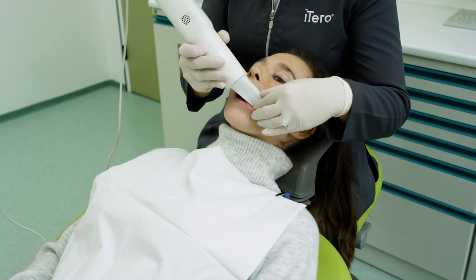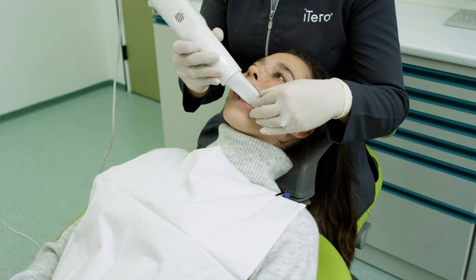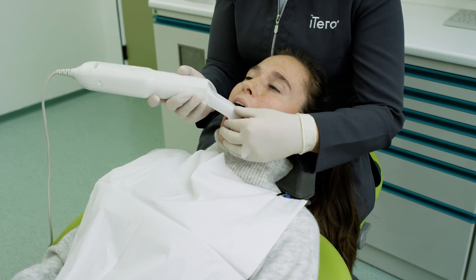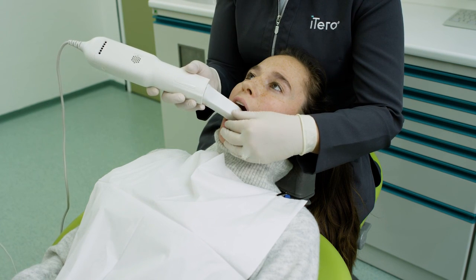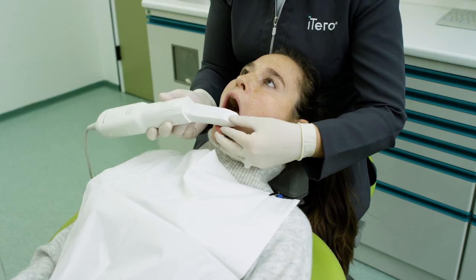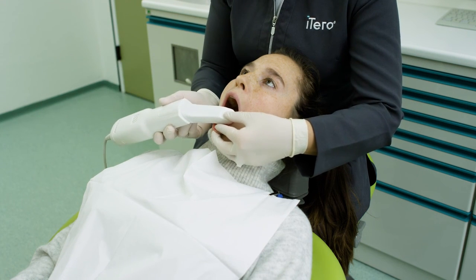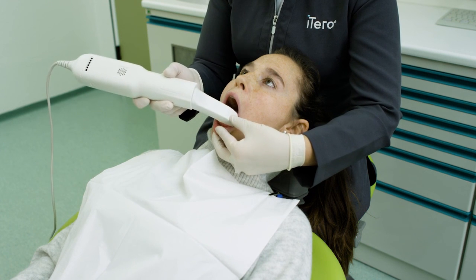Next, swing the cord end of the wand out towards the cheek. To capture the interproximal surfaces in patients with crowding, use a twisting motion as you bring the wand around the lingual surface of the arch, and a rocking motion as you bring the wand around the buccal surface of the arch.